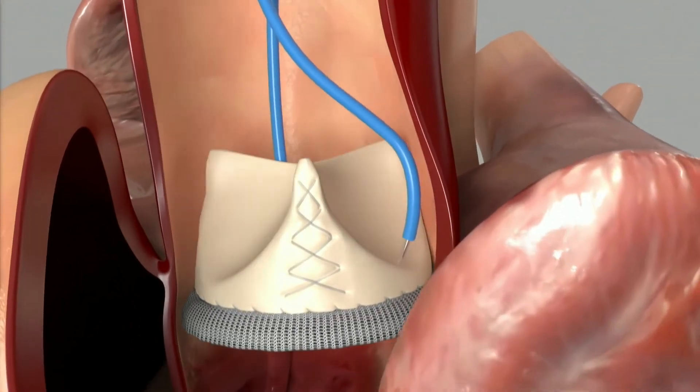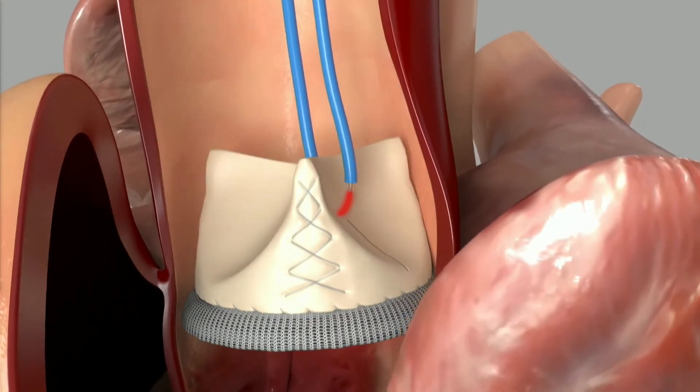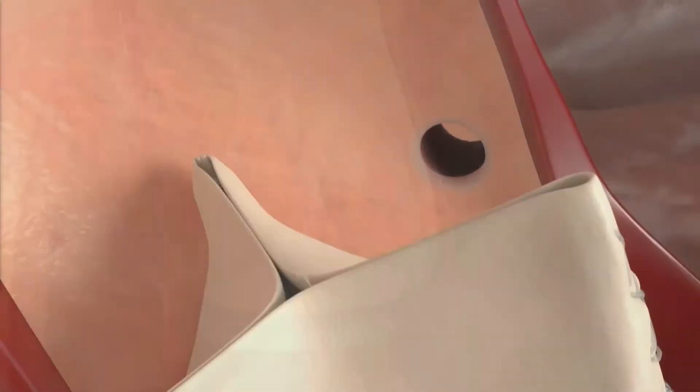We tighten that guide wire loop so only about two millimeters of guide wire is exposed when we electrify again, and pull both catheters upward, lacerating that valve in the center.